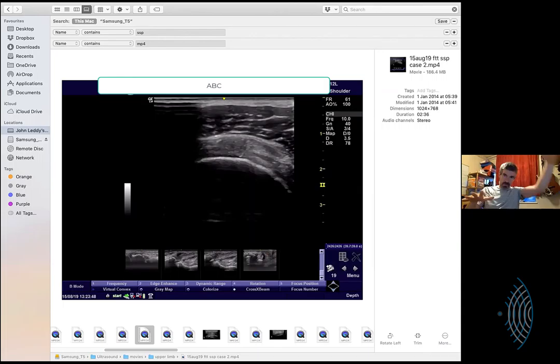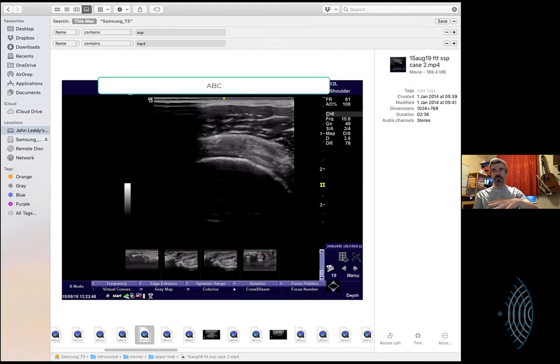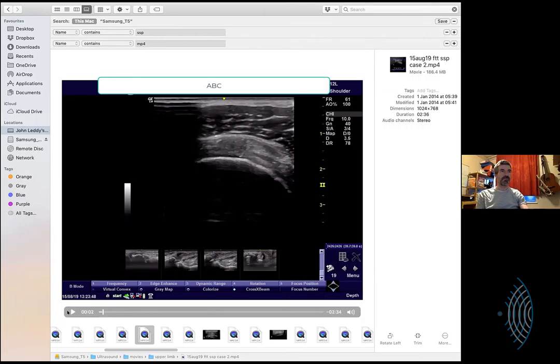A little bit proximal to the insertion, but you can usually make out the capsular layer on a good quality scan, with a straightforward patient. You see the capsule rising up over the long head of the biceps, a layer of tissue that is not quite as well defined in orientation as the front of supraspinatus, coming up and rising up over.